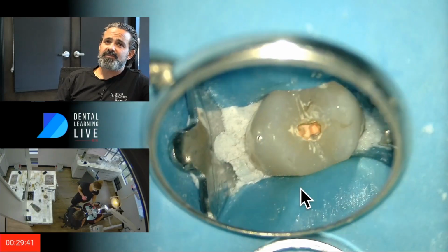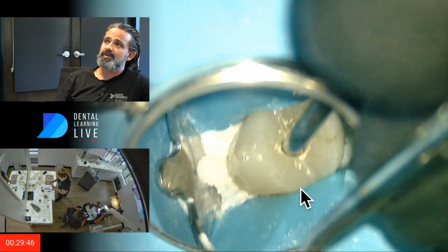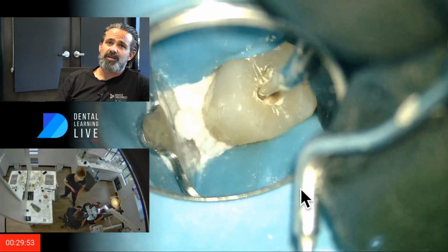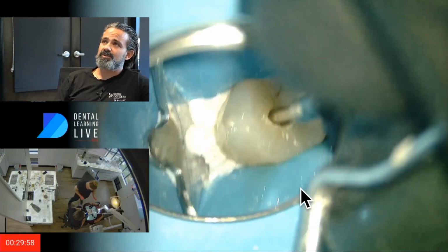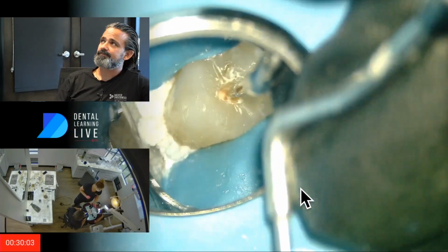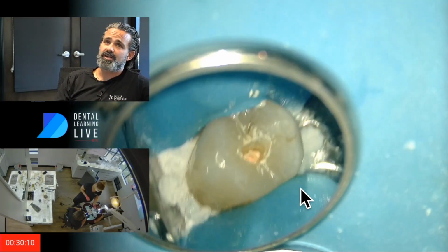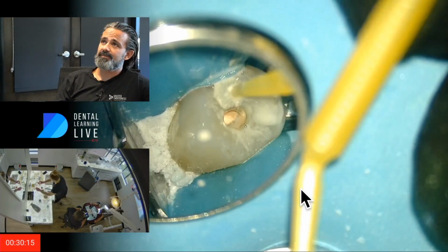I oftentimes feel like we're judged by the way that chamber looks, the access chamber looks. So I do like to burnish it down really nice, and sometimes I'll take a burr and clean things up. And I usually will clean up all the sealer and everything before I put the sponge. So just the first thing my referring doctor looks at is a nice clean access. It's important to me. The other thing, if you go back and look at the x-ray, we had those fillings. They did not leak during the procedure, which is great, which means there's no secondary caries going on.